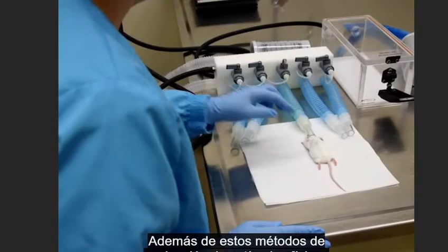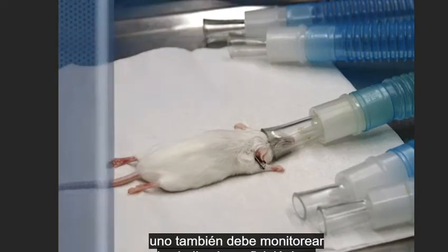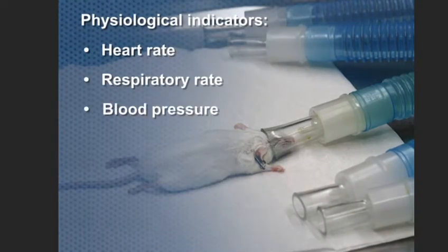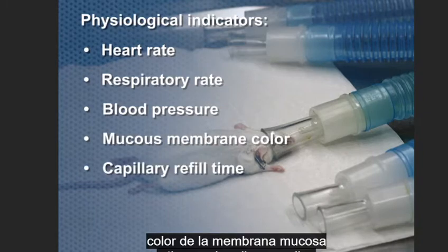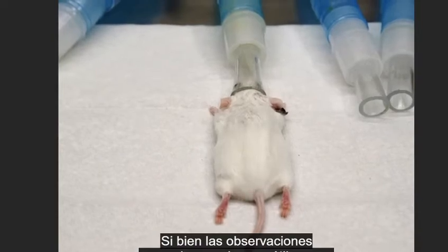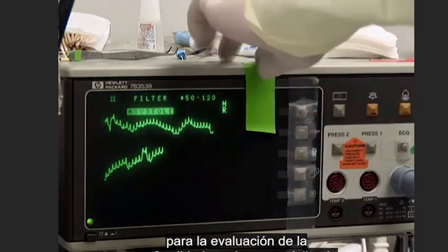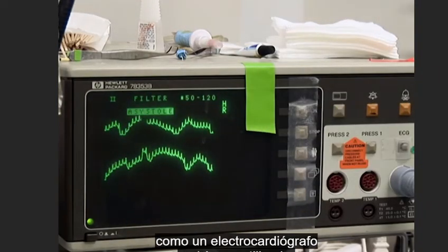In addition to these physical stimulus methods of assessment, one should also monitor physiological indicators including heart rate, respiratory rate, blood pressure, mucous membrane color, and capillary refill time. While general observations can be useful to detect changes in respiratory rate, to utilize heart rate for depth assessment, specialized equipment like an electrocardiograph may be used.